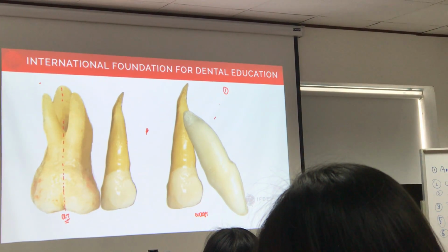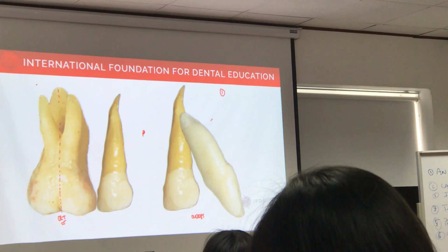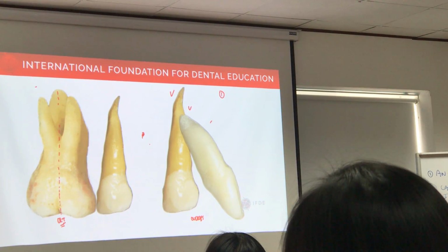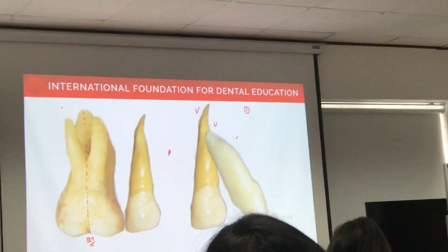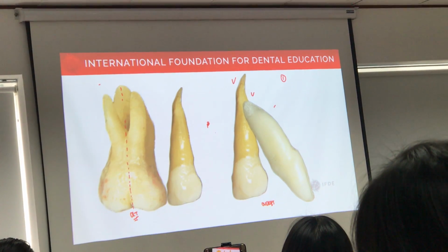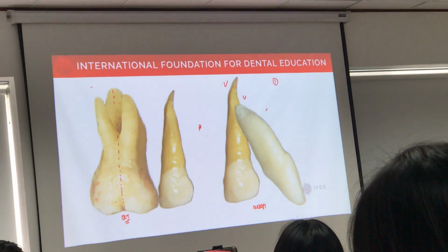So the goal of treatment is to take this unit here, which is tooth number 3, and tooth number 1 and 2, which I didn't draw, to retract. The goal of treatment is to retract the block of six anterior teeth backward. So, what type of movements do you need to do first?